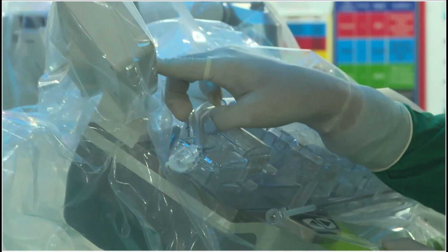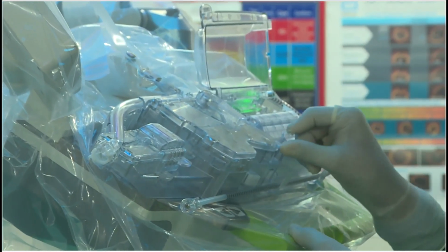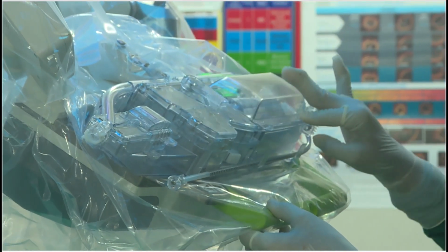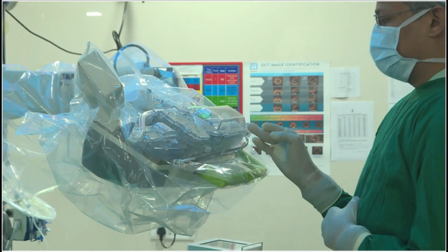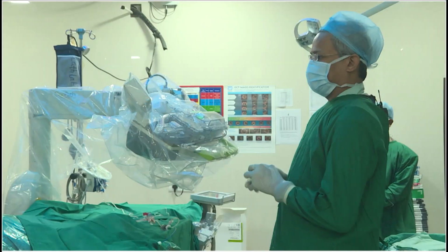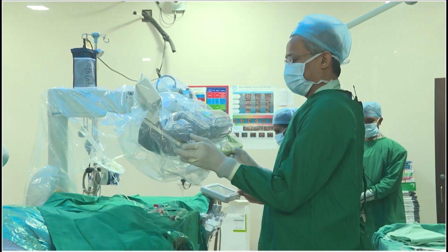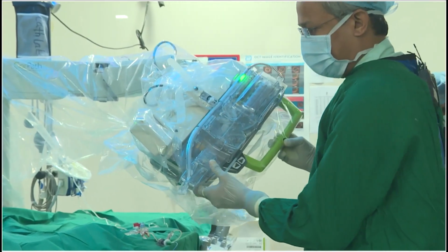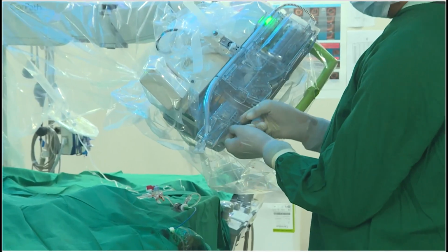So the instructions we can see over here. We have to open the rotatory cabinet. We just follow the instructions as they are given. The cassette is preparing itself. You can see the movements. The cassette checks the rotating arm. If everything is fine, the next message will appear over here. So the robot has asked us to tilt to 30 degrees for us to have an angle to the catheter. So they have asked us to load the catheter now.